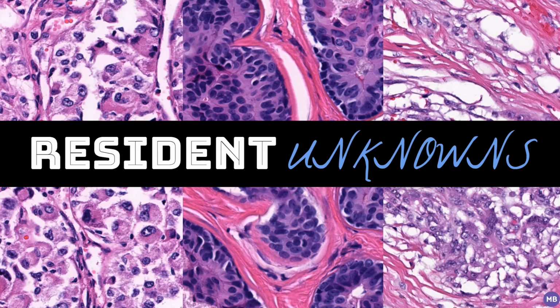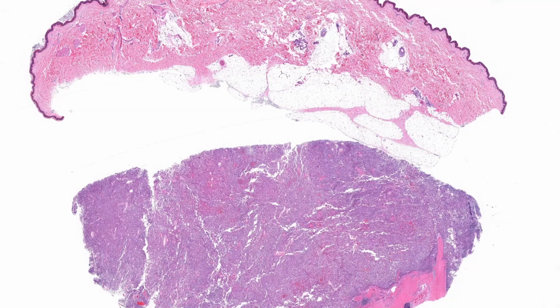I'm a fourth-year pathology resident at Emory University, and in this video I'm going to be going over 3 interesting cases in dermatopathology and soft tissue pathology. As usual, you can find the links to the digital slides in the video description.